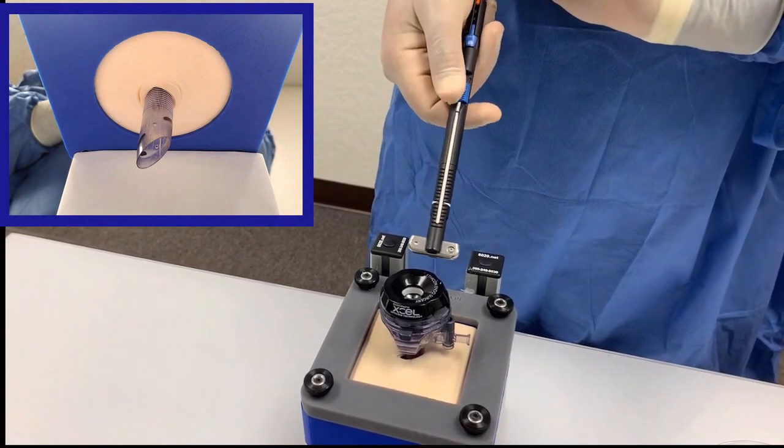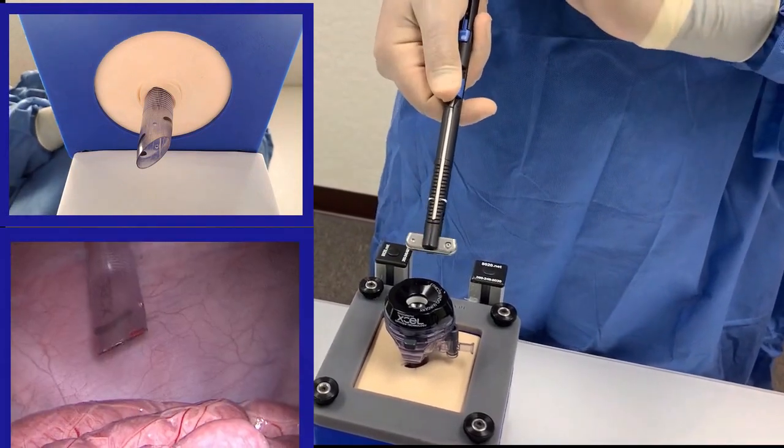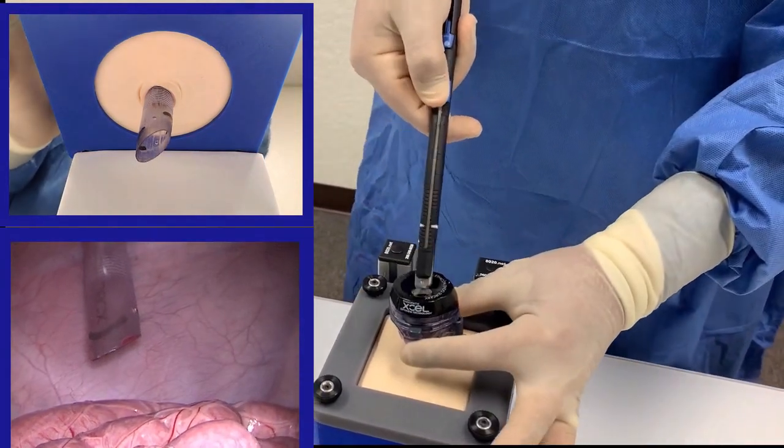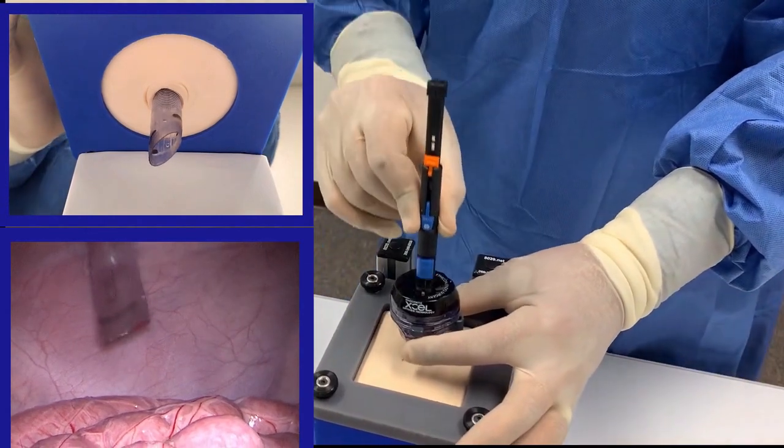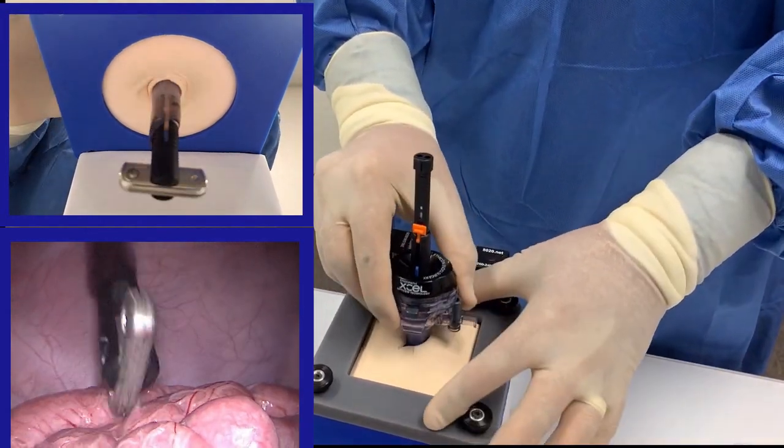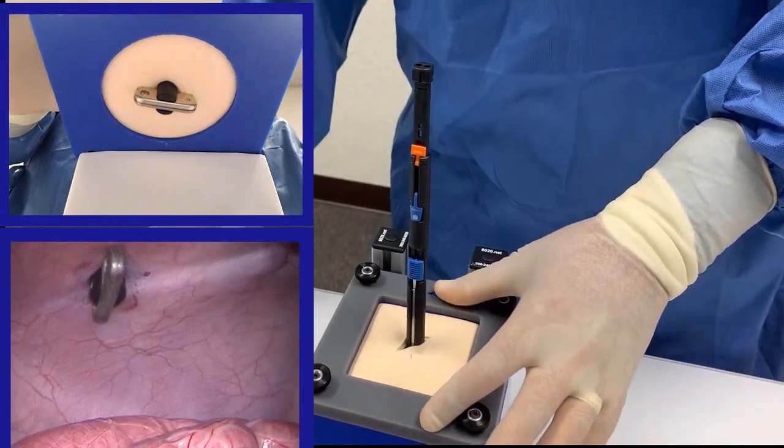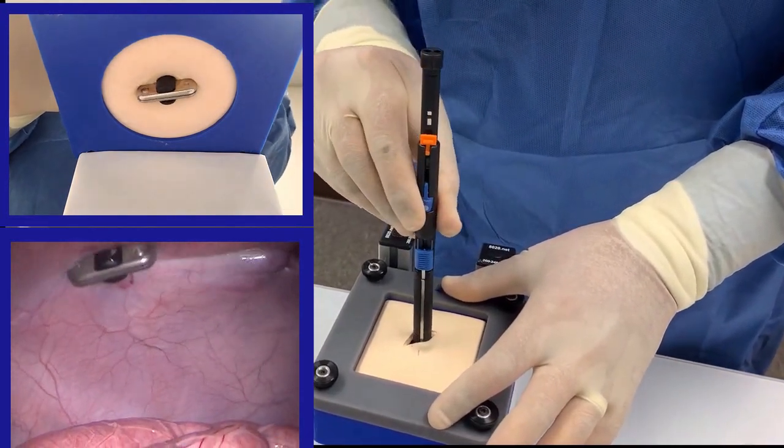M-Close is easy to use. M-Close can be inserted percutaneously or through any 12mm or larger trocar. Once the t-bar automatically springs open, you can remove the trocar and position the t-bar into the desired orientation.